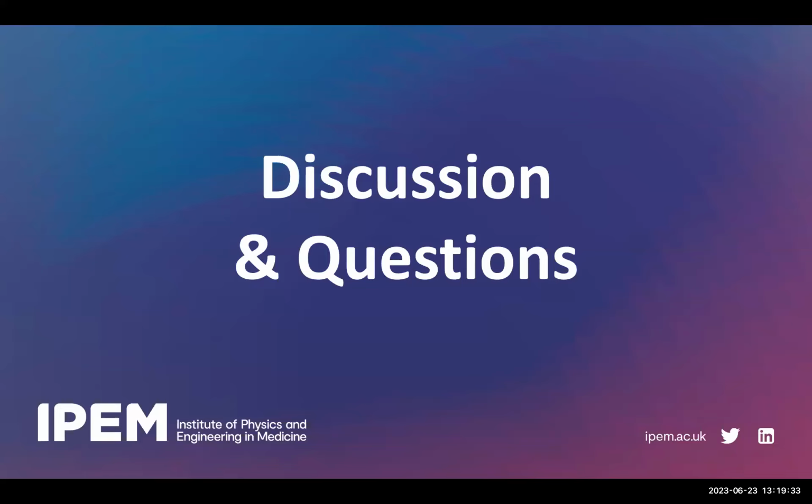So the question was Deep Resolve Sharp. I think the GE AI is probably, as far as I can tell from what we've seen there, a deep neural network. So as I'm trying to get my head around from listening to Simon, it's probably similar to Deep Resolve Boost then. Would you agree with that, Simon? It's a neural network. It's denoising the images.